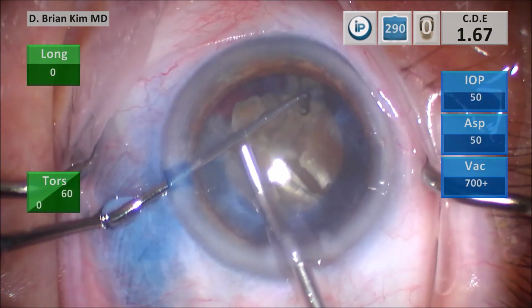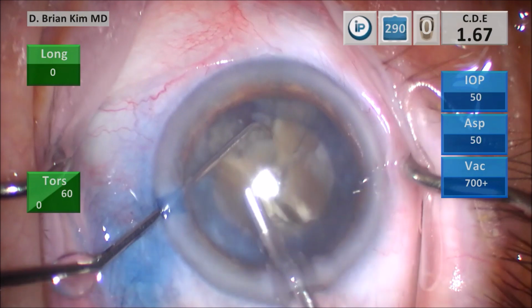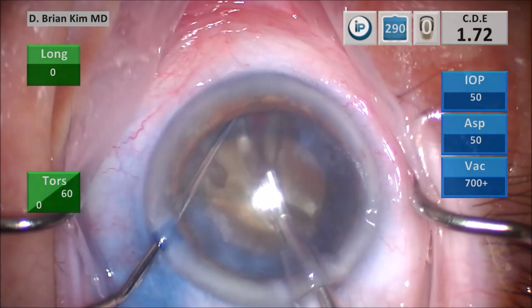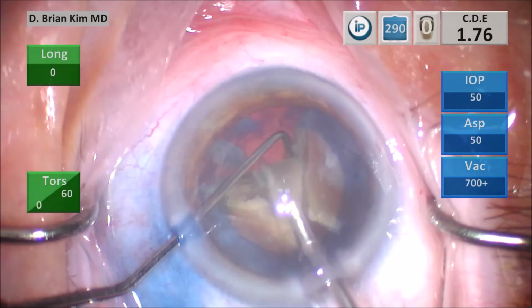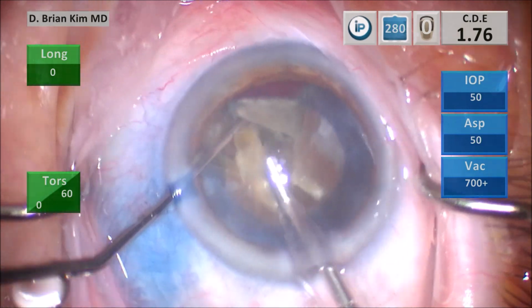You can see again, I'm using some vacuum to lift the piece up and then using that scissoring maneuver to amputate the posterior adhesion. Again, grabbing it, lifting it up, and then chopping and amputating the posterior adhesion again.